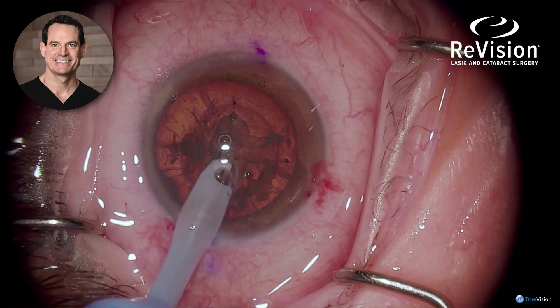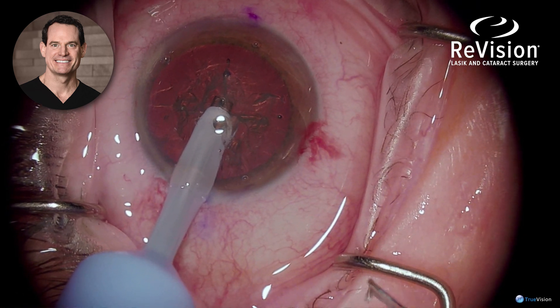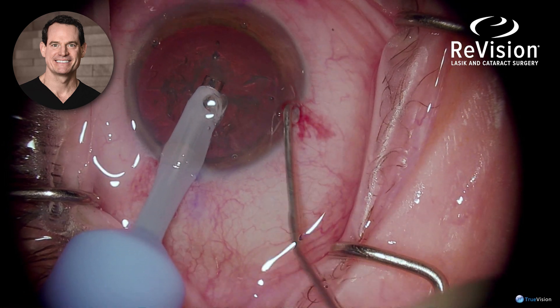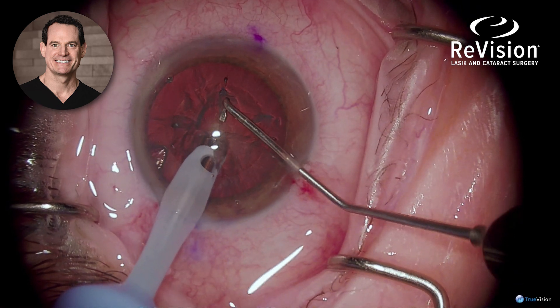The phaco tip is introduced. And as you'll notice, because this is laser-assisted, the capsular rhexis has already performed the opening in the lens capsule and the lens has been pre-divided.